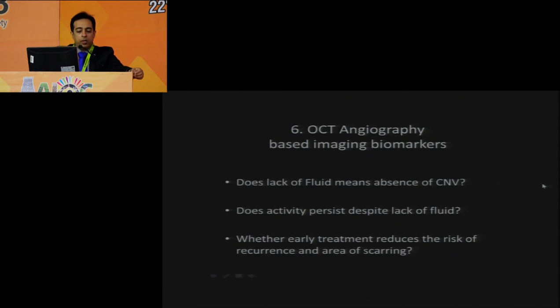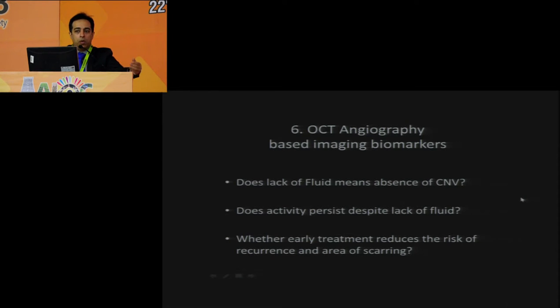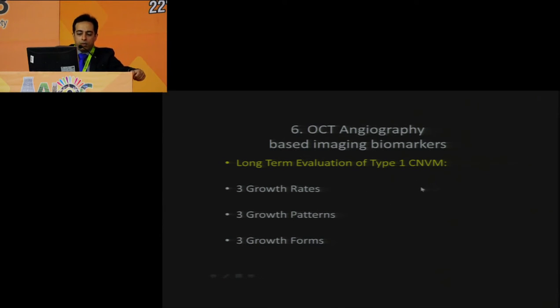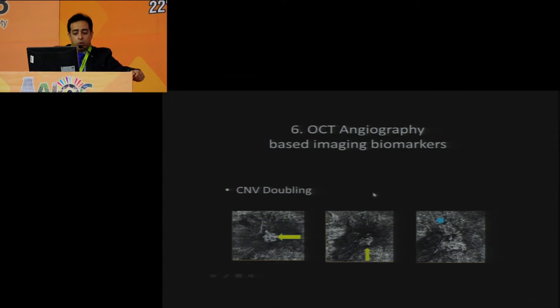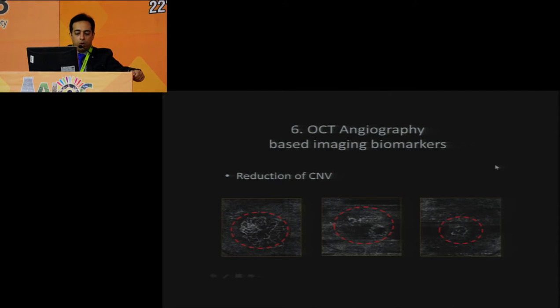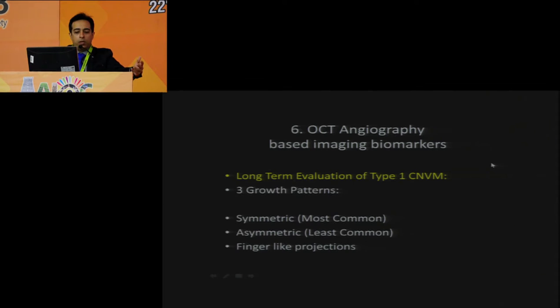The question arises: does the lack of fluid on OCT mean absence of CNV, or does activity persist despite lack of fluid? OCTA further helps define aspects beyond OCT alone. Long-term evaluations of type 1 CNV include growth rates (doubling, modest growth, or frank reduction), and we are still understanding the predictive value of any single imaging frame in the long run.